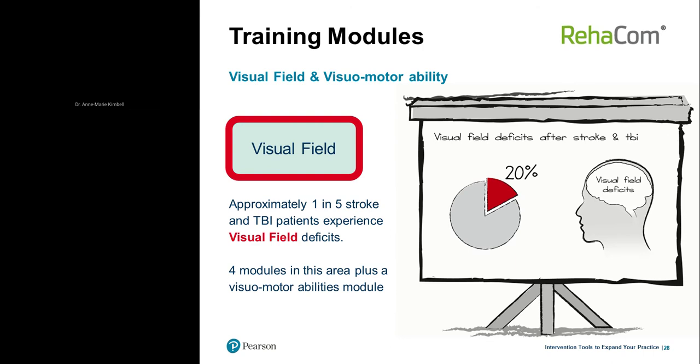And this is another common attentional disorder resulting from unilateral hemisphere damage, again, most commonly from a stroke. Patients with neglect just don't pay any attention to the space on the opposite side to their injury. A lot of patients recover spontaneously, but about 40% of patients have symptoms that persist. And so visual scanning therapy is widely used in rehabilitating patients with this type of neglect. That mainly involves encouraging them to explore that neglected side of space, often with the help of visual cues. And so the trainings allow the therapist to implement visual exploration and visual scanning training with the patient.